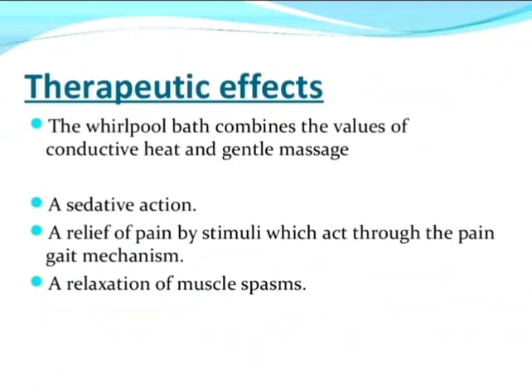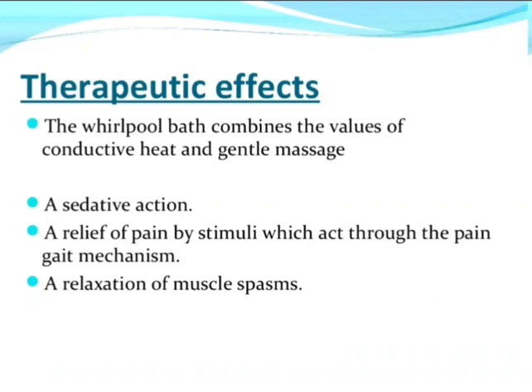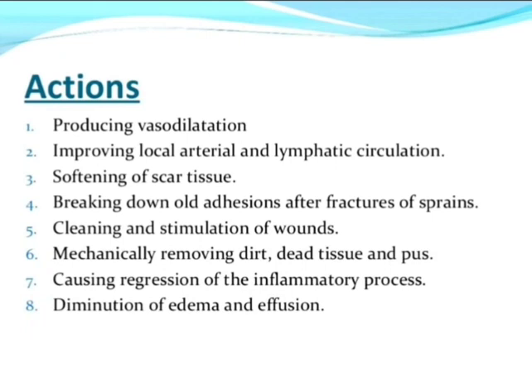Next are the therapeutic effects. The Whirlpool bath combines the value of conductive heat and gentle massage. So it gives a sedative action, relief of pain by stimuli which act through the pain gate mechanism, and relaxation of muscle spasms. It mostly produces vasodilatation and improves the arterial and lymphatic circulation.